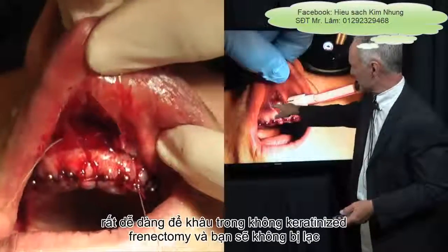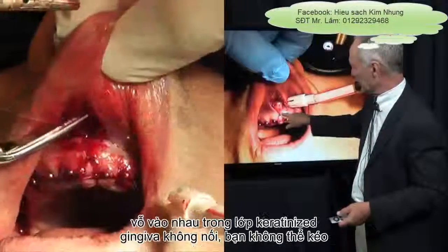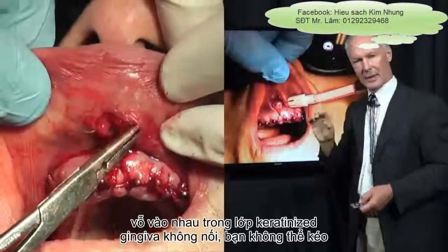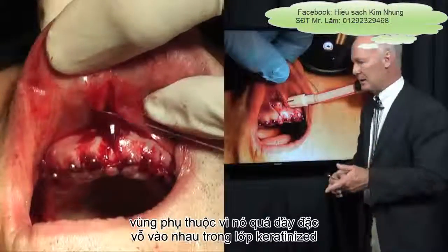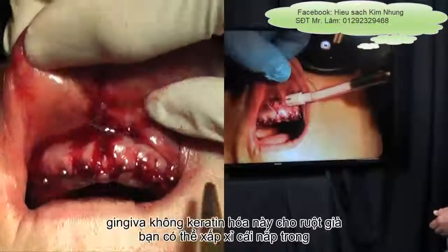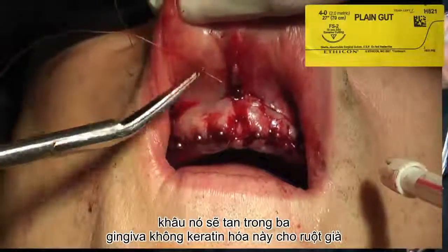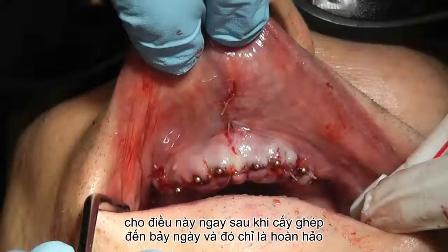This is easy to suture in the non-keratinized, unattached gingiva. You can't pull the flap together in the keratinized, attached area because it's too dense, but you can approximate the flap in the non-keratinized gingiva. This 4-0 gut suture will dissolve in three to seven days, and that's just perfect for this.